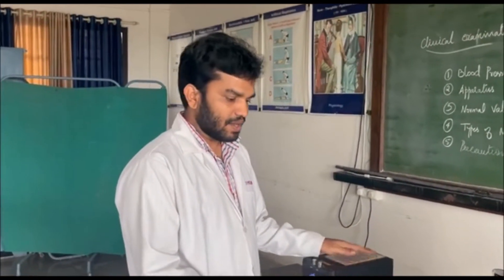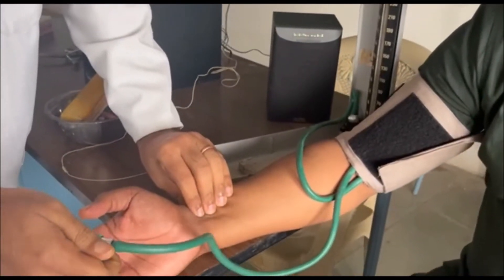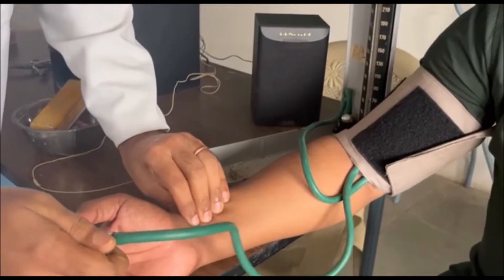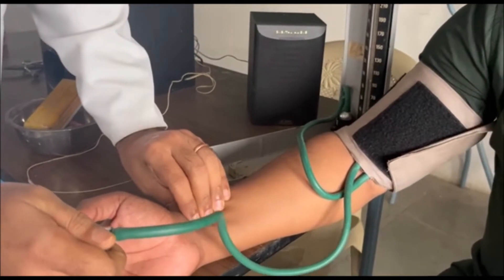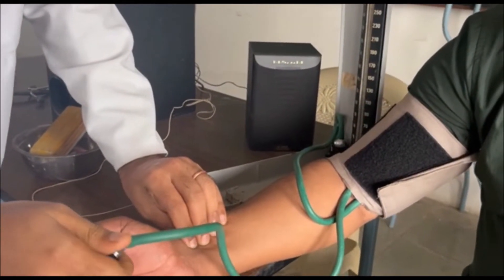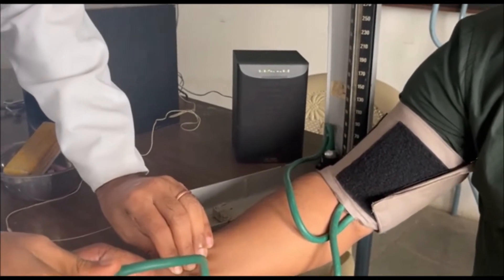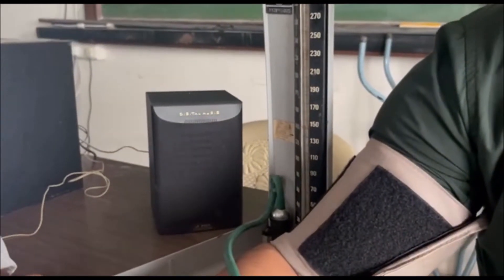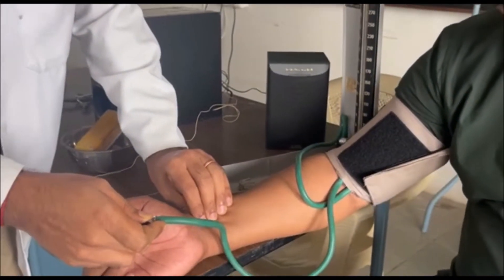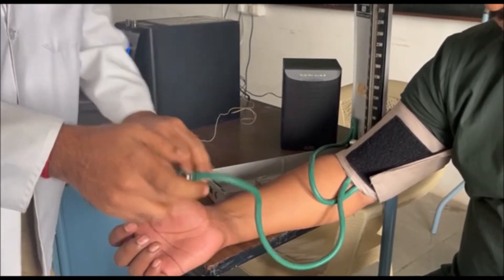So now we will start. Same as the palpatory method, we want to start first — where the pulse disappears. Above that, 30 mmHg we want to increase, and then release the pressure until the pulse sensation comes back, and release the pressure.